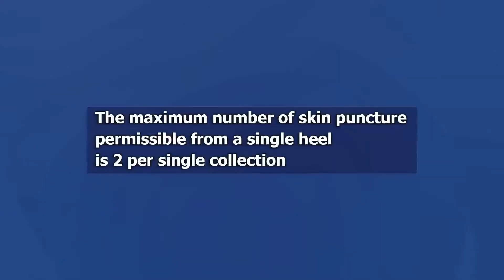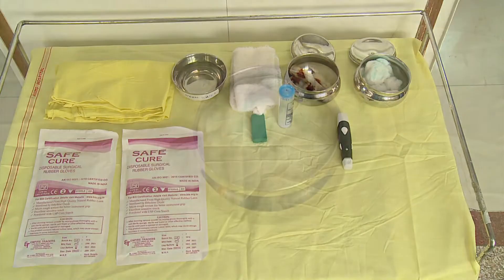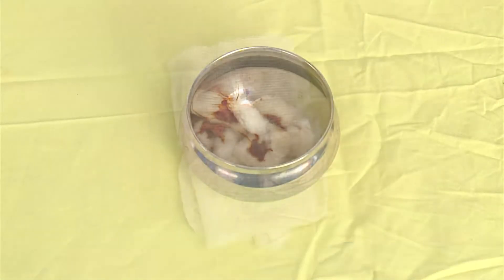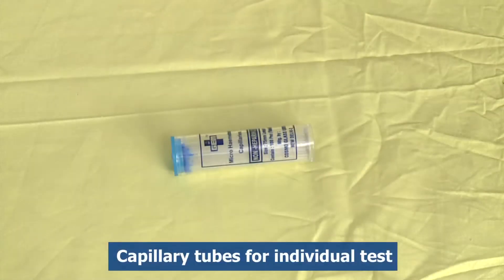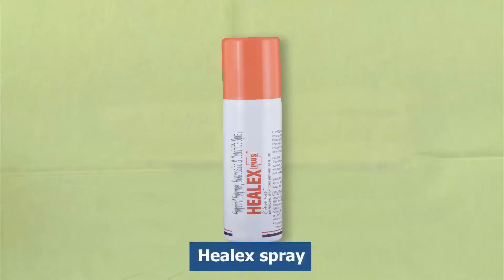The maximum number of skin punctures permissible from a single heel is two per single collection. The equipment required includes cleaning solution, i.e. spirit or isopropyl alcohol and betadine, one sterile 2x2 gauze, lancet and capillary tubes for individual tests, sterile gloves, and Healex spray.